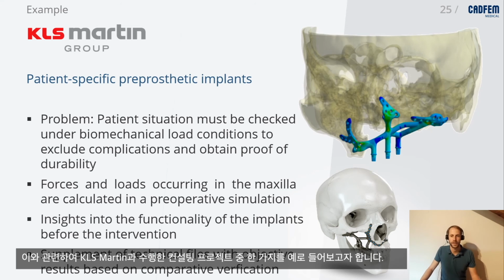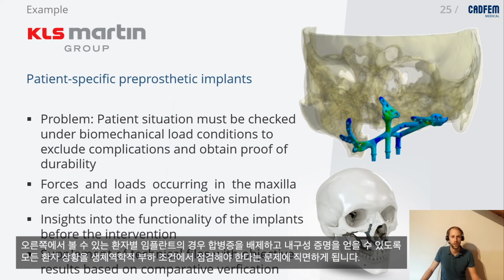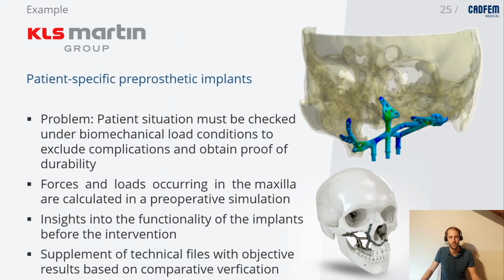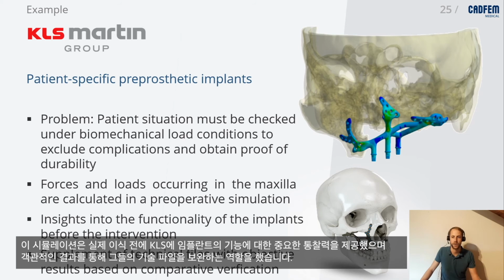In this regard, I would like to give an example from one consulting project we conducted for KLS Martin. For patient-specific pre-prosthetic implants, which you can see on the right here, they faced the problem that every patient situation must be checked under biomechanical load conditions so that they can exclude complications and obtain proof of durability. We therefore determined the forces and loading of the implant when virtually implanted into the maxilla in a preoperative simulation. This simulation provided crucial insights for KLS into the functionality of their implants before the actual intervention and served as supplement of the technical files with objective results.